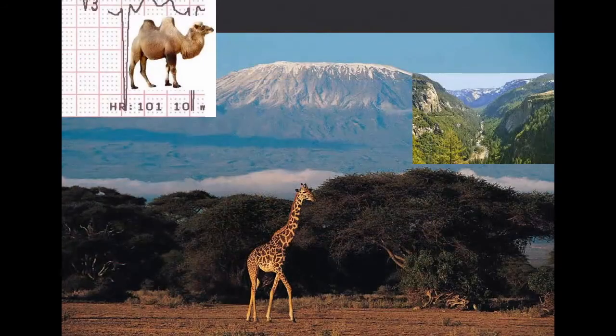So I decided I might as well just make my own. Right. So what I decided is that if you triage them, you'll say the camel is climbing Mount Kilimanjaro and falling deep down into the valley. So can you see there, that's bad, but not so bad. This becoming longer is bad, and once you fall down, it's just death. All right. I'm not too sure why the giraffe is here, but in any case.